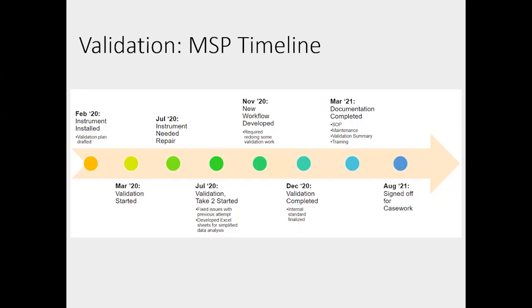So we decided to use that instead of these longer runs, and that did make the workflow a lot nicer, but we had to decide whether or not we wanted to continue scanning more voltages, or if we just wanted to simplify our process, use the 30-volt data, and get the benefit of some auto processing that the instrument would do. So we decided to use the auto processing and only scan for 30 volts since we were using it for screening. So we had to adjust our method of how we were going to sample a little bit.